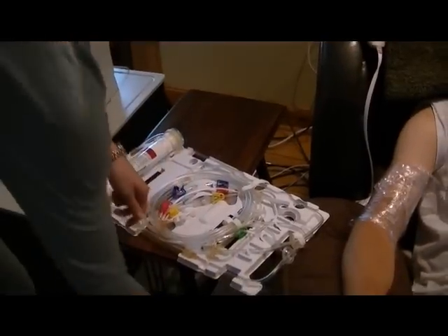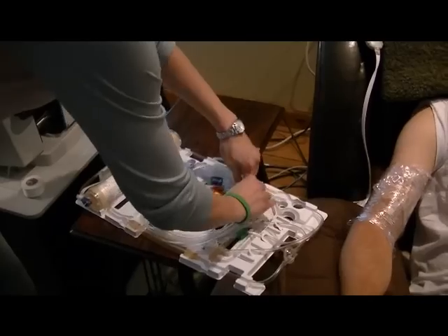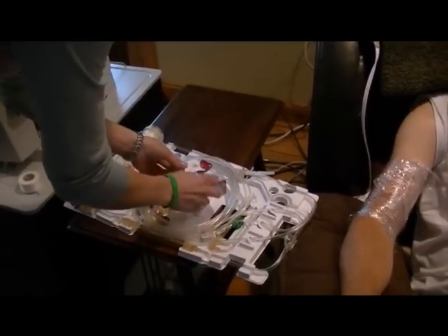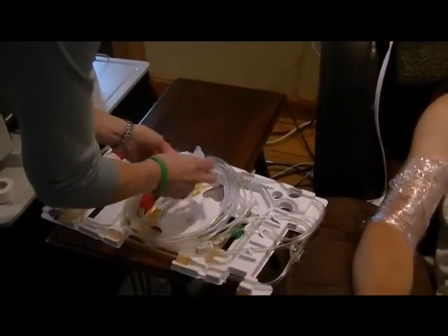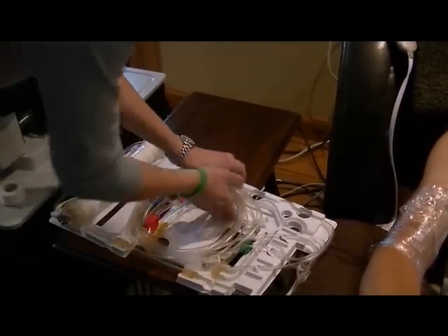This is the cartridge that we use for the machine and you have to pull off all the tabs and make sure all of the connections are tight, so you just double check on them before you put it in the machine.